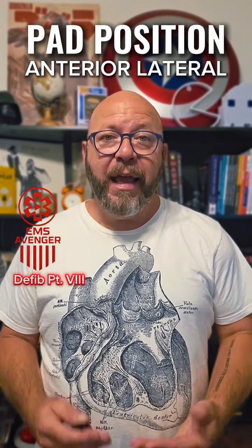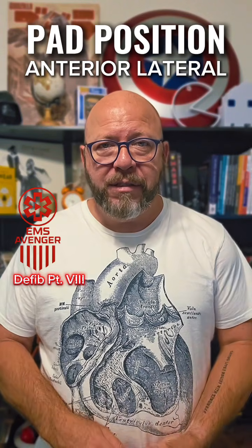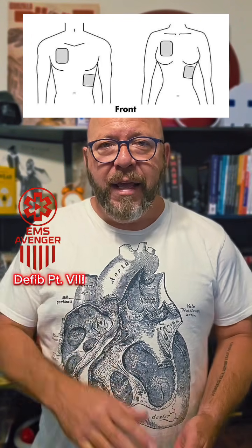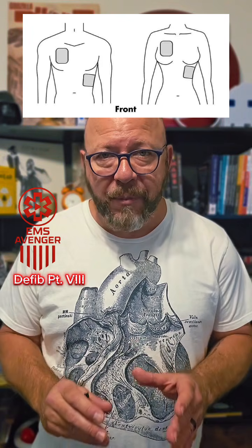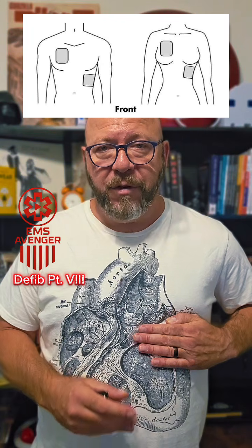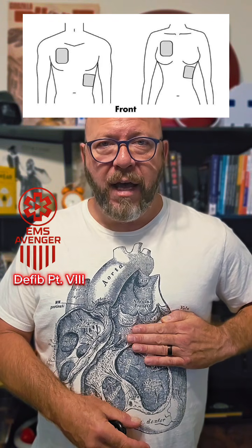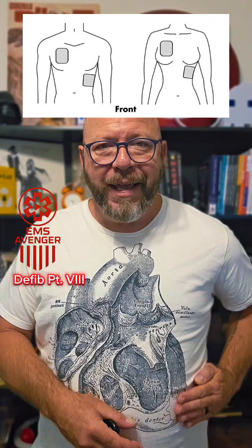That's why with anterior lateral placement, what the AHA recommends is your anterior pad, or your sternal pad, goes just below the clavicle and to the right of the sternum. And then your lateral pad, or your apical pad, which is the pad that is most commonly misplaced, goes just below the pectoral line. And if your patient is a woman, it goes below the breast, always below the breast, but not anteriorly. That is a very common misplacement, either the pad being too anterior or too inferior.